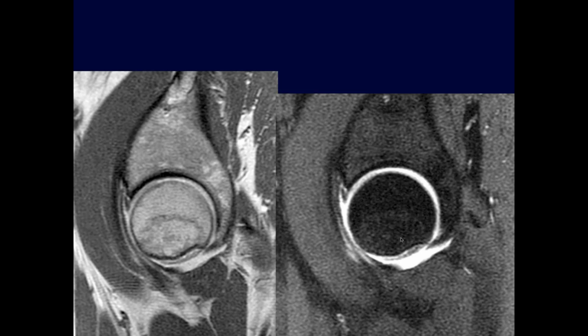Okay, that's you. So there's some irregularity of that anterior superior labrum right there. I think it goes all the way through. I'd be worried about a tear. There might even actually be a small paralabral cyst, maybe right there, yeah, with the arrow.